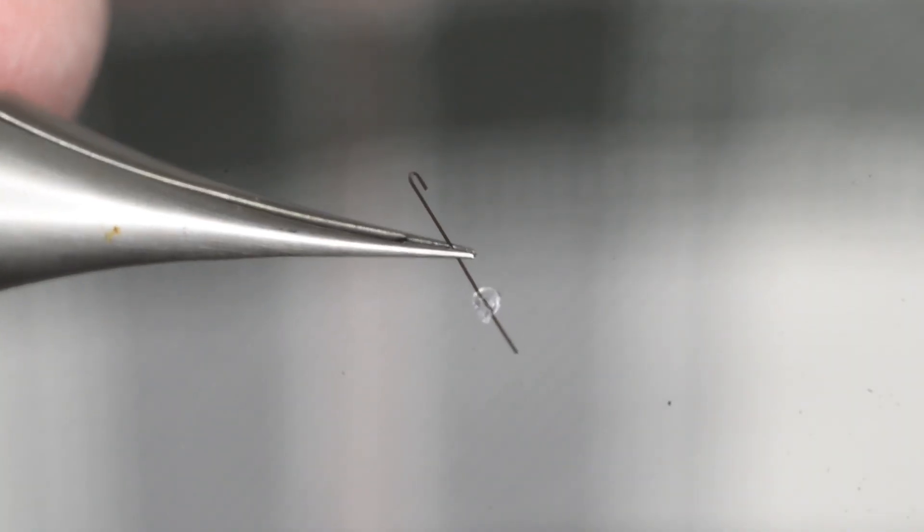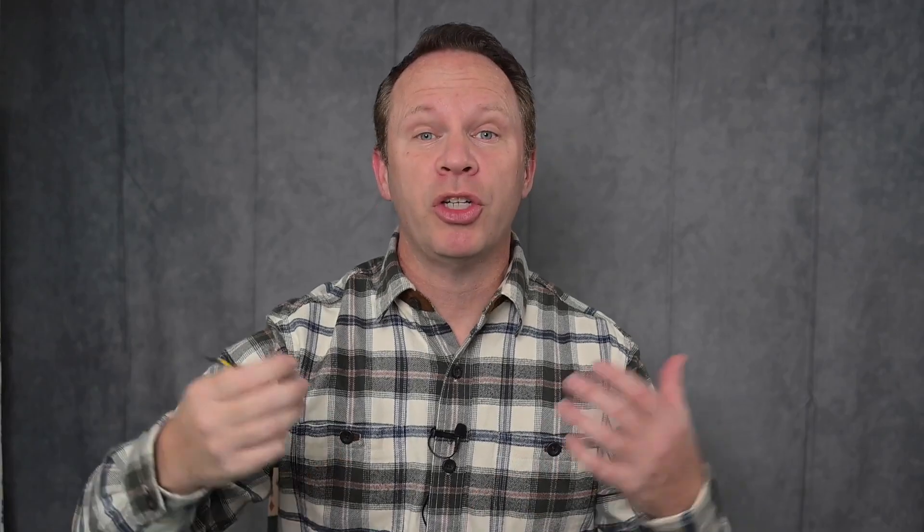You can't see it? It's our flexible iris retractor. I wanted to show a quick way to use the flexible iris retractor for something other than small pupils.